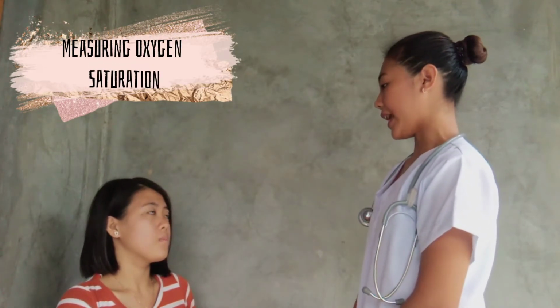Now we will be taking your oxygen saturation. Let me borrow your finger and I will insert the oximeter to identify your oxygen saturation. This is a digital oximeter.